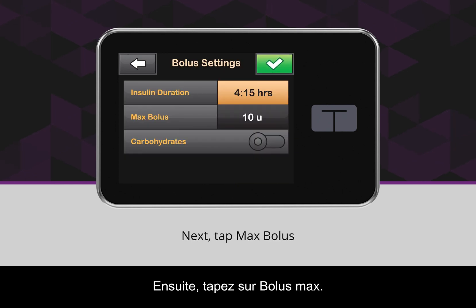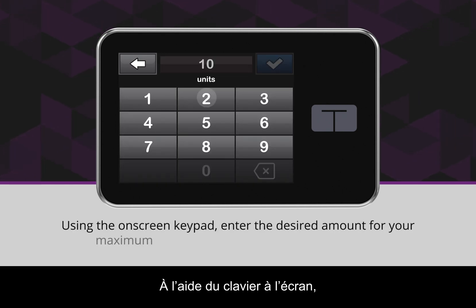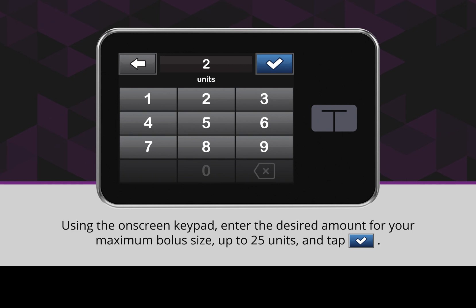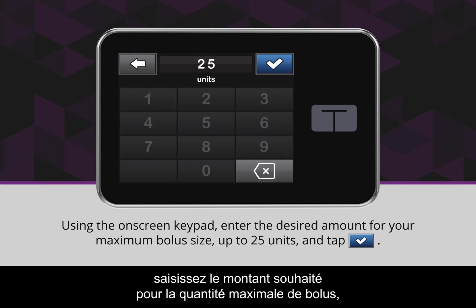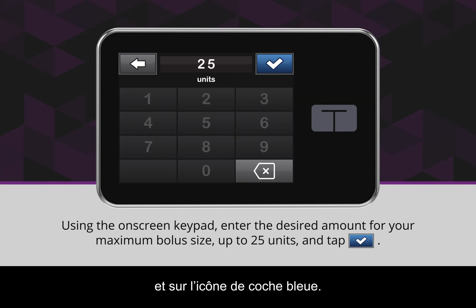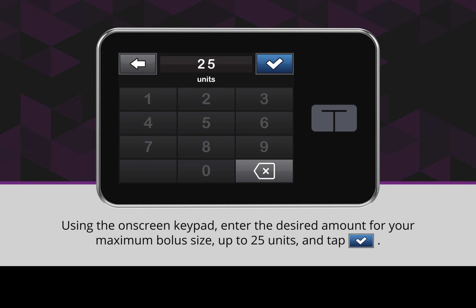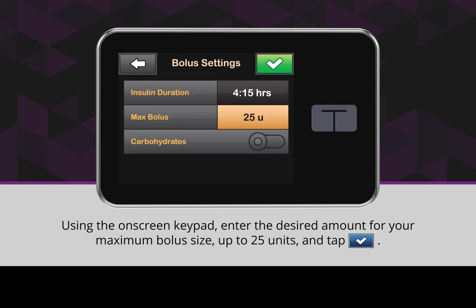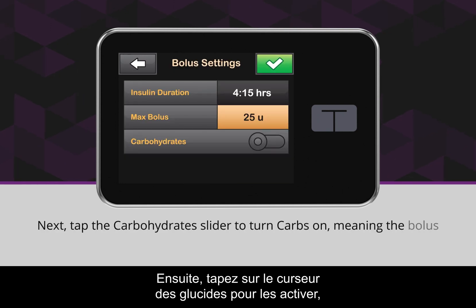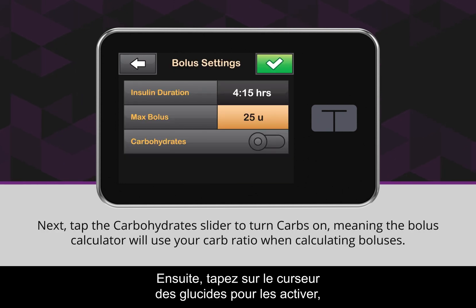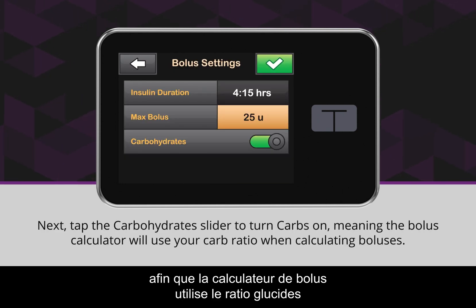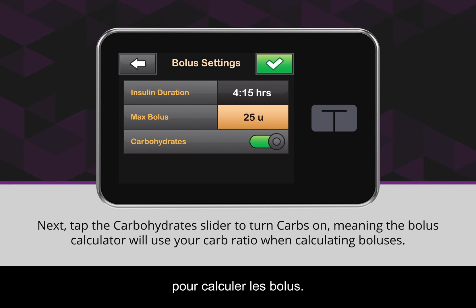Next, tap Max Bolus. Using the on-screen keypad, enter the desired amount for your maximum bolus size and tap the blue checkmark icon. Next, tap the carbohydrate slider to turn carbs on, meaning the bolus calculator will use your carb ratio when calculating boluses.